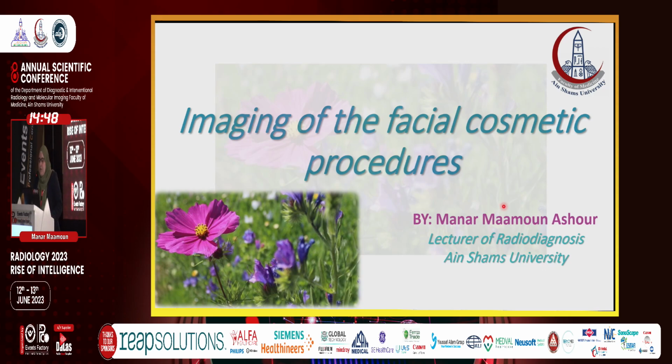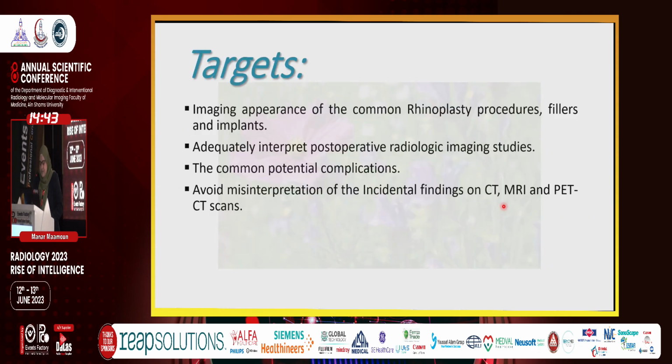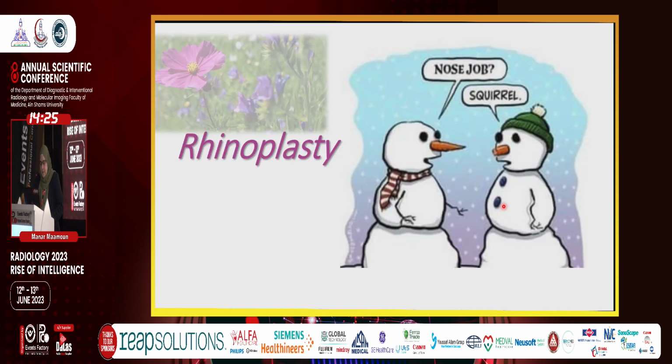Okay, I'll talk about a light topic, which is imaging of the facial cosmetic procedures. We will have an idea about the imaging appearance of the common rhinoplasty procedures and implants to adequately interpret their post-operative radiologic findings and to adequately interpret the common potential complications and to avoid misinterpretation.